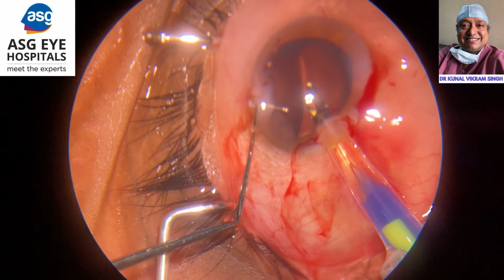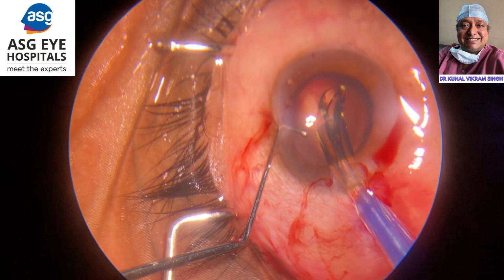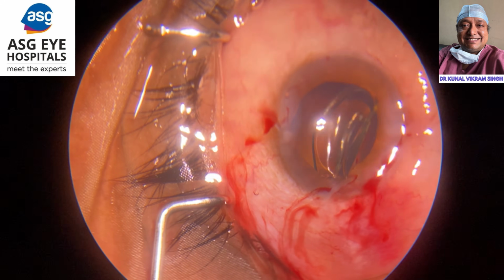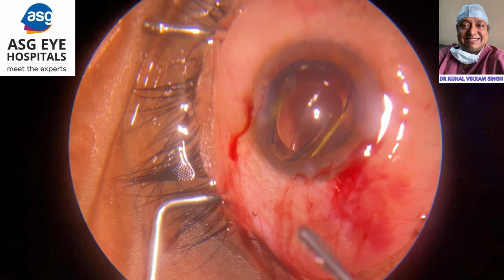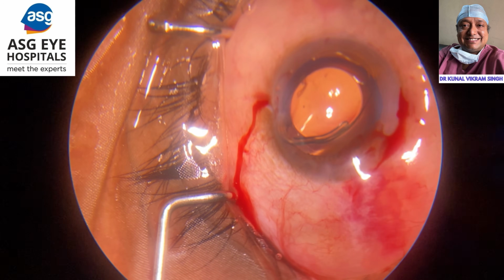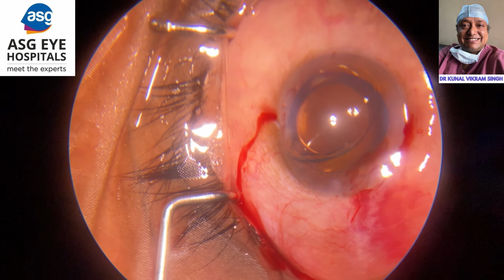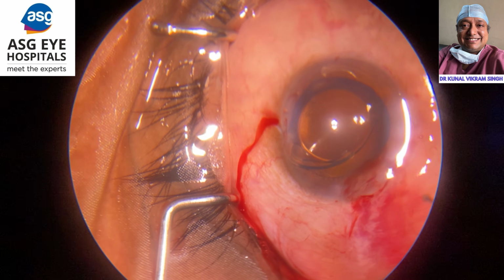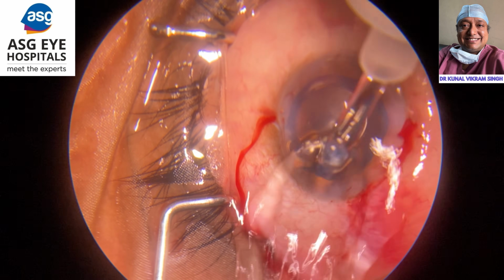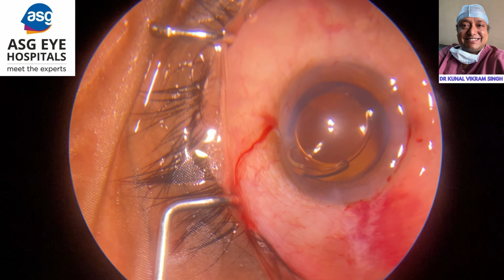But the posterior capsule was dome shaped and almost touching the posterior surface of the cornea, that is the endothelium. So it was very difficult for me to implant the IOL in the bag. I thought I'd implant it in the AC, maneuver both the haptics into the bag, then constrict the pupil, wash the AC with the hydrocannula and close the case.